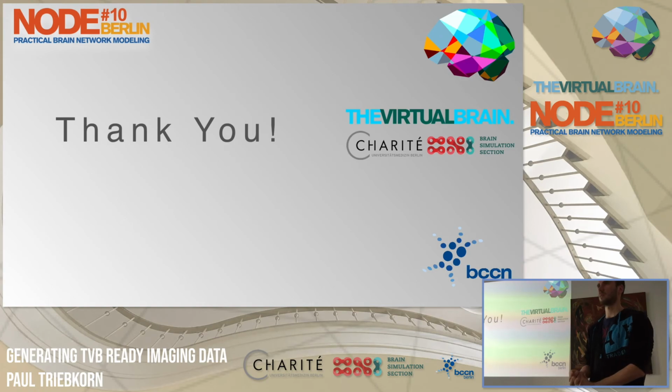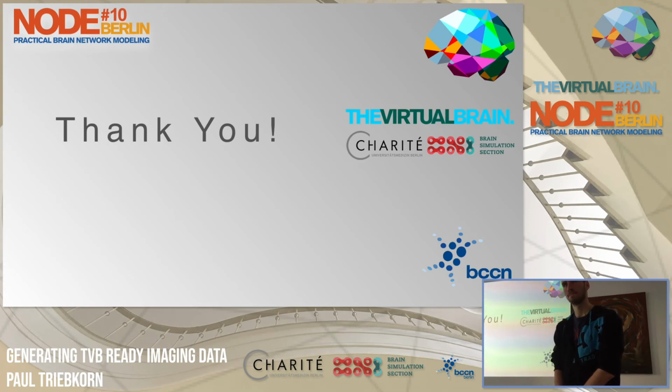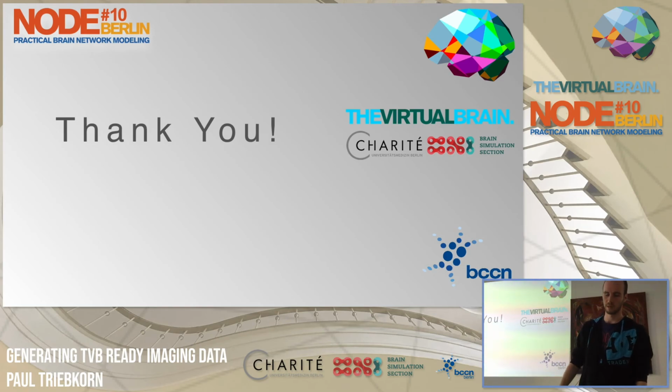Yeah, it takes some time to get this knowledge, to get more insight into the different steps, but I think it's worthwhile the effort. Yes? It's a related question, but I'm wondering for these pipelines, how much tuning of parameters is required by hand per subject or per data set? Right. And you also ask about identifying the problems and where they come into play.